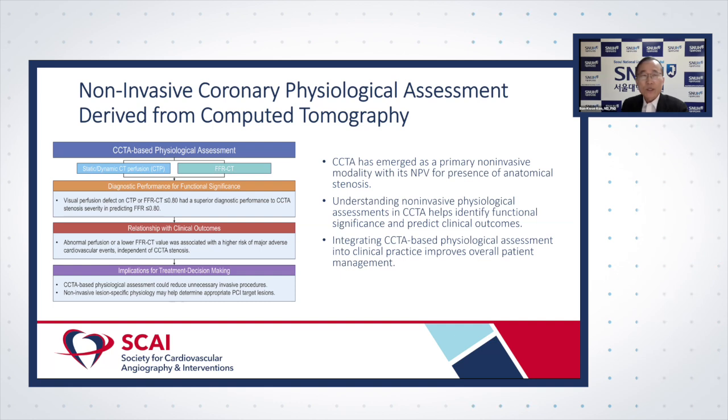And also a recent meta-analysis from Dr. Nørgaard's group showed that a negative CT-FFR with medical treatment was associated with a low risk of hard endpoints, such as the risk of MI and death. So I think that while using more CT-derived FFR, we can better discriminate the patient risk and select the appropriate treatment for the patient with chronic stable coronary disease.